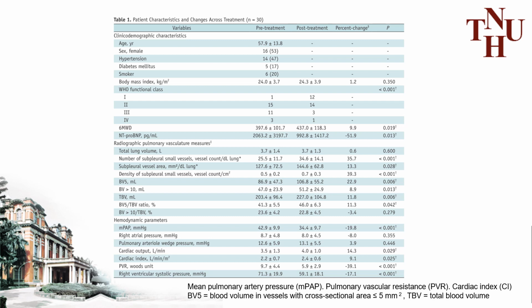This is the demographic data and measurements of the 30 persons, including the pre-treatment, post-treatment, and percentage change about clinical CT measurements and right heart catheter hemodynamic parameters.